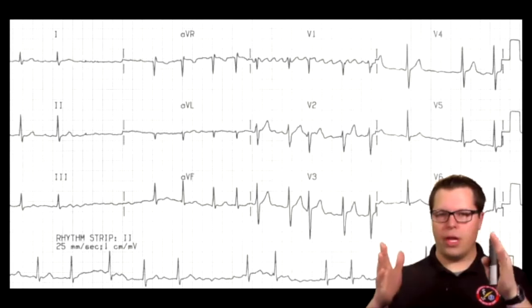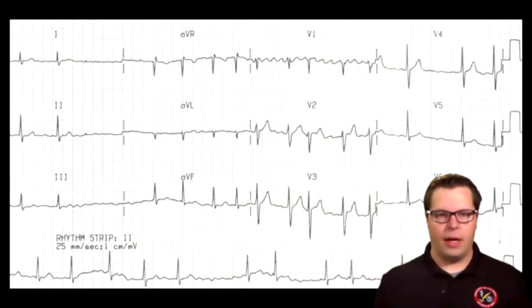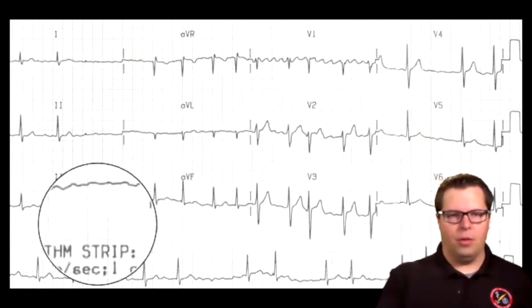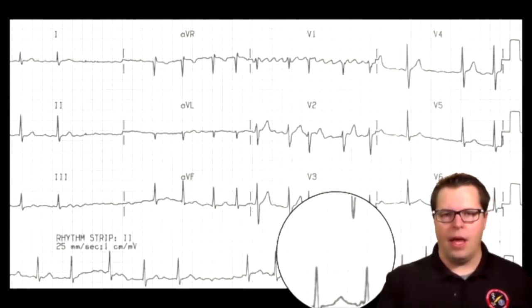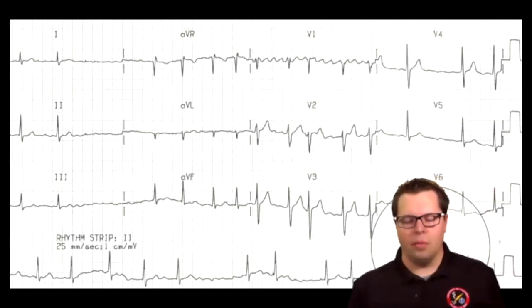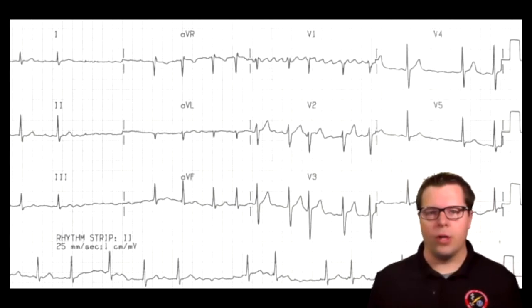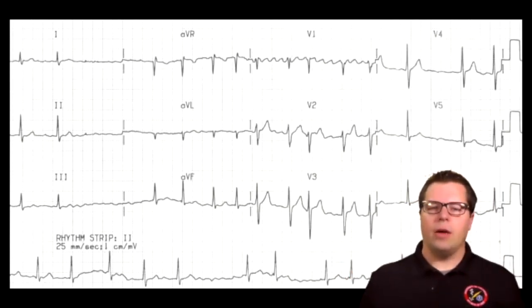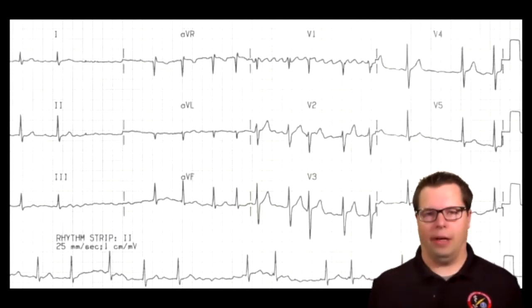So as long as your standard EKG is 10 seconds long, or represents 10 seconds of time, you can count how many QRS complexes down at the bottom: 1, 2, 3, 4, 5, 6, 7, 8, 9, 10, there's a couple behind me, 11, 12, 13, 14. Multiply that by 6, which is 60 plus 24, 84. So rather than that discrepancy, is it 100, is it 50? No, the true rate is actually 84. It's just irregular.